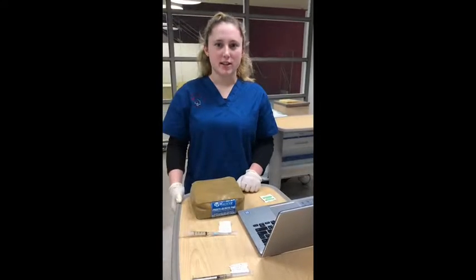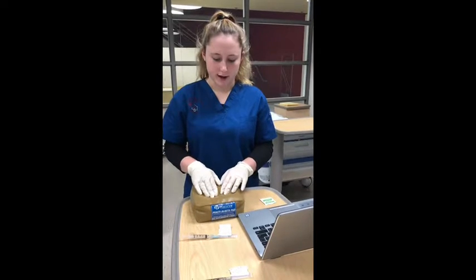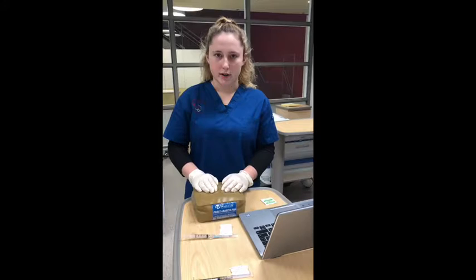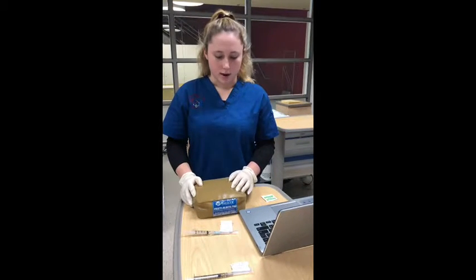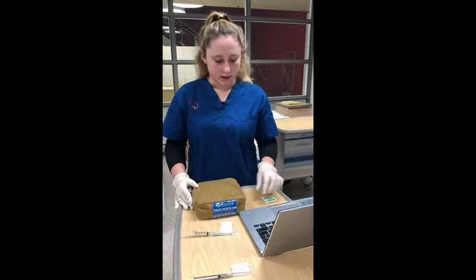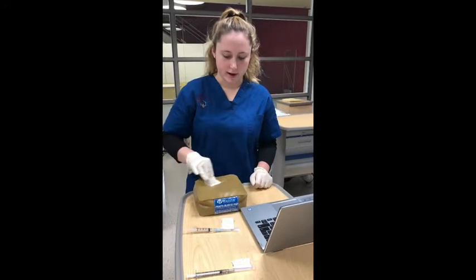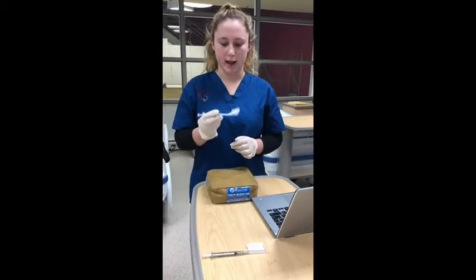So for my subcutaneous injection, I would start by palpating the abdomen, just looking for any lumps or bumps or any sign of bruising or tenderness, and I would pick the correct spot. And then what I would do is clean the area. So I'll take my alcohol swab and clean around the area, and then dispose of that in the garbage. So I'm gonna remove the cap on the needle.